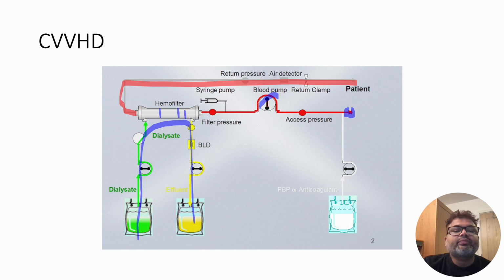So here it's just diffusion working, but along with that pump is there. So you have to decide in the prescription how much fluid you have to remove and put there, and that much amount of ultrafiltrate will be removed with the ultrafiltration mechanism.